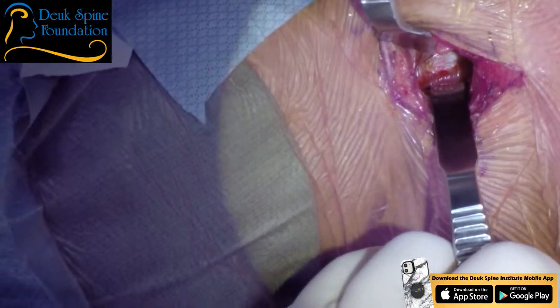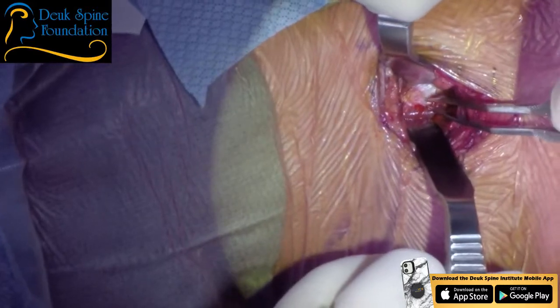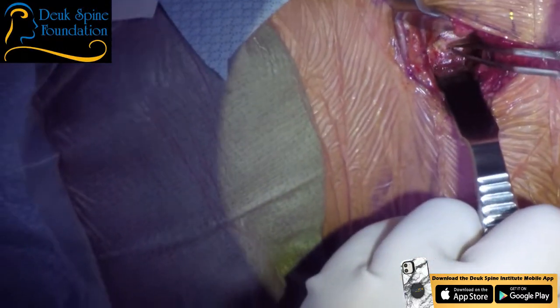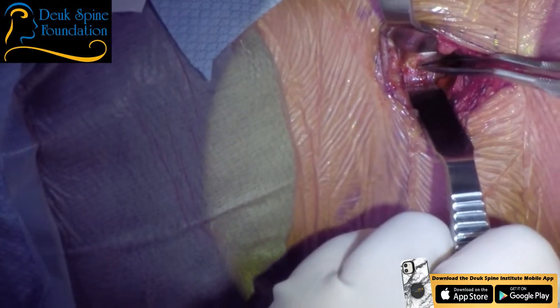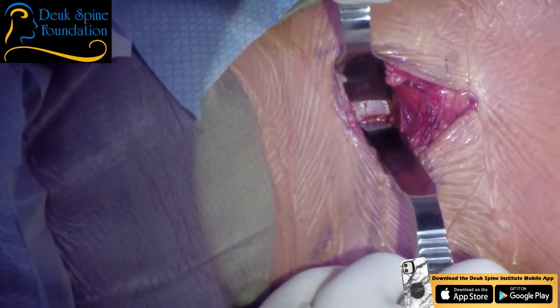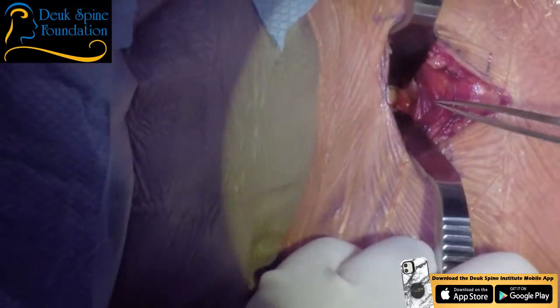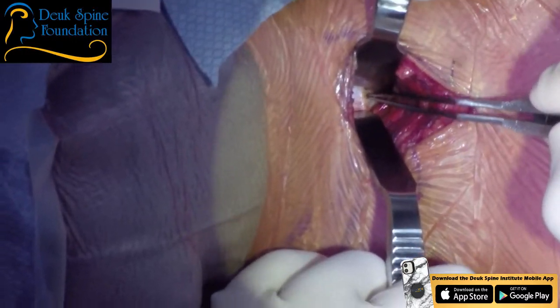It'd be really nice if I can get a localizer, take that bipolar, or give it to Patel bipolar. If I can just get something in 5-6 to be absolutely sure. But there's a lot of inflammation in front of 5-6, you know? And that inflammation, I think, probably indicates an issue with the anterior disc. Okay. Scissor, never mind, it went right here, show me. That's gonna be 6-7 right there.